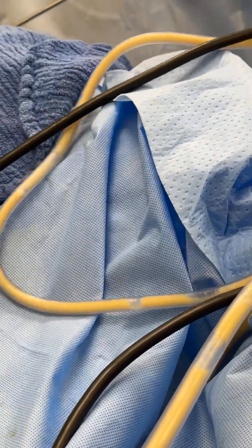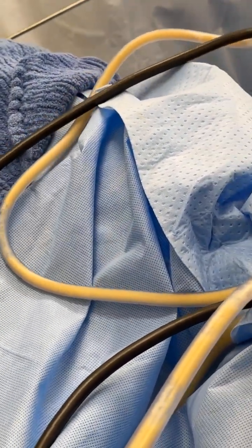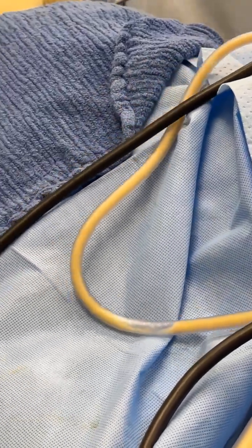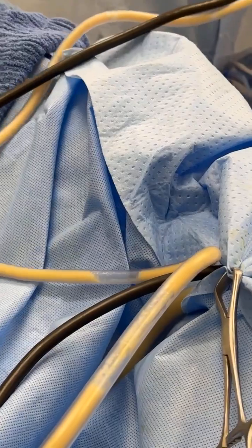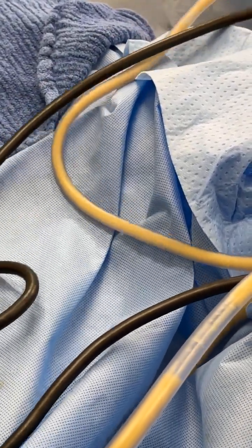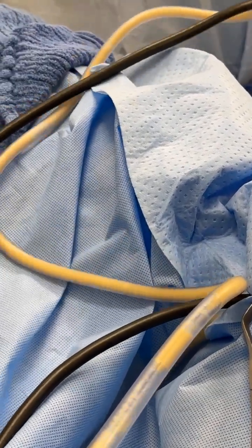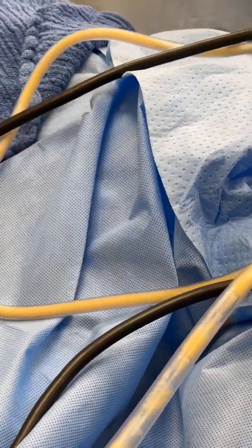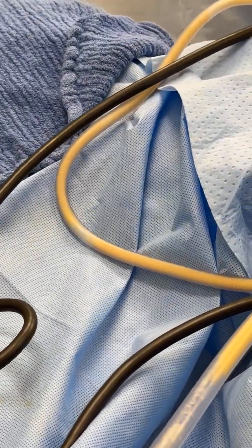Or when you're driving a car and you're going so fast, maybe you're tired or didn't sleep well, and you lose control of the vehicle and go somewhere you're not supposed to — you go off the road. I think that's what happens when you perforate an internal organ. That has never happened to me, thanks to God, but I believe it would be almost impossible for anybody using this technique to perforate an organ, even using their non-dominant hand.